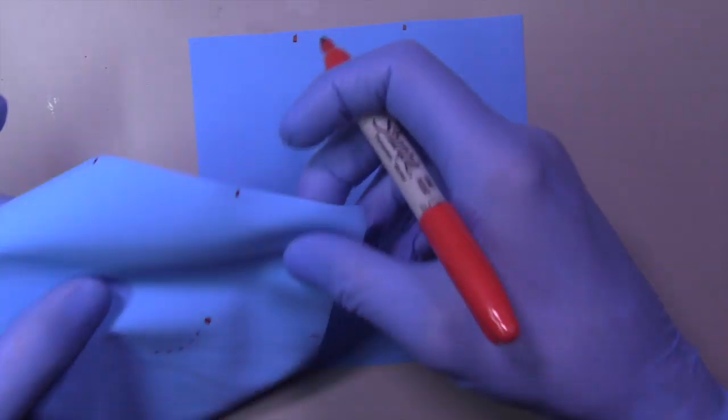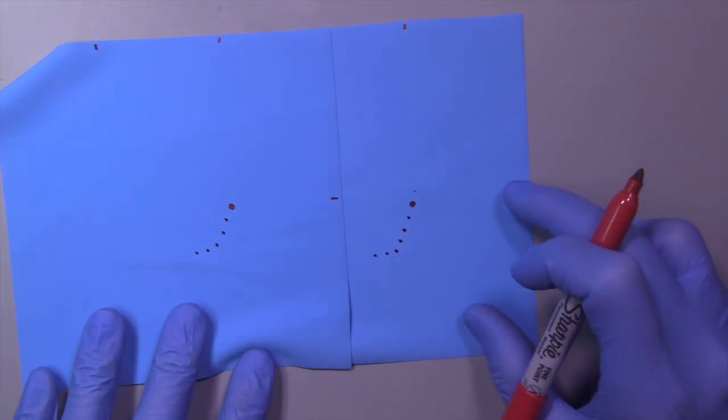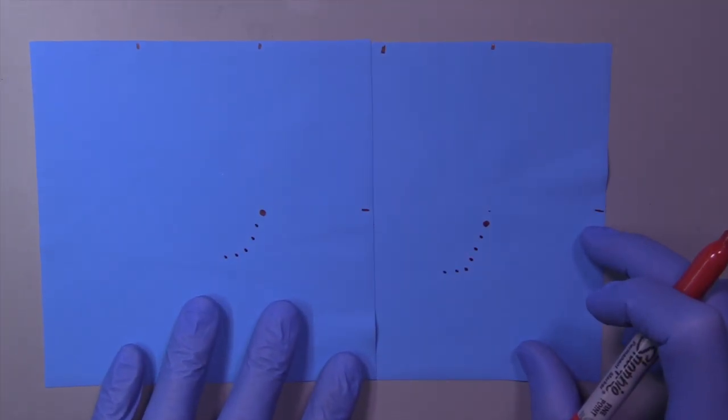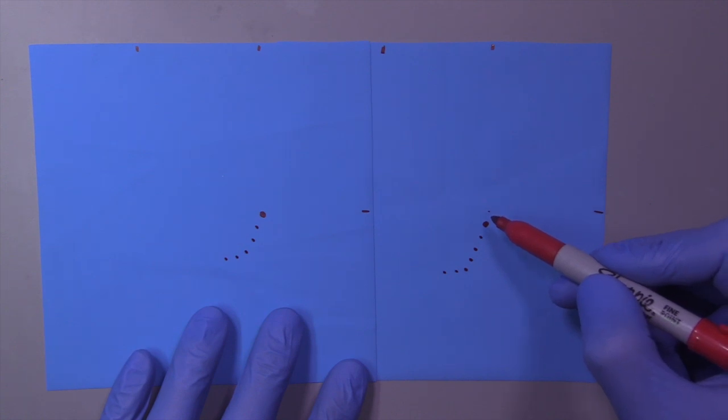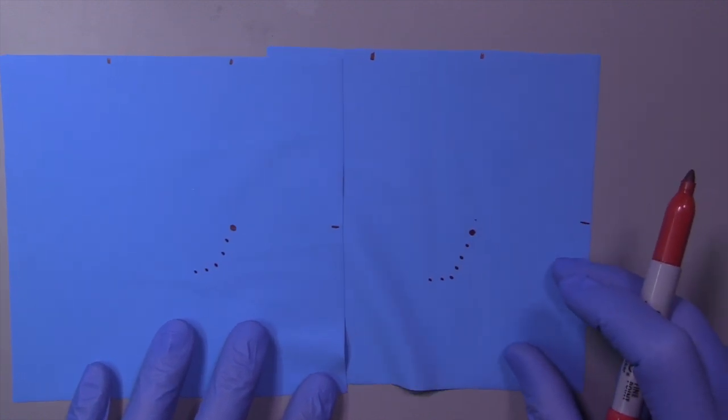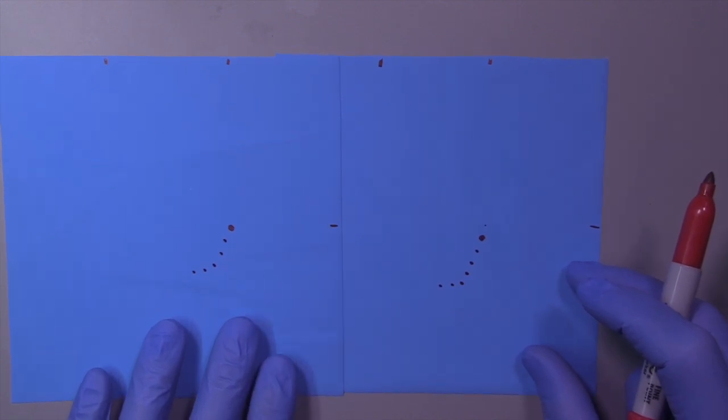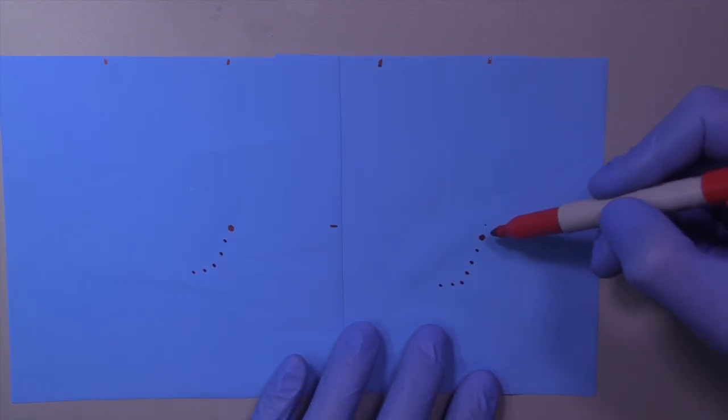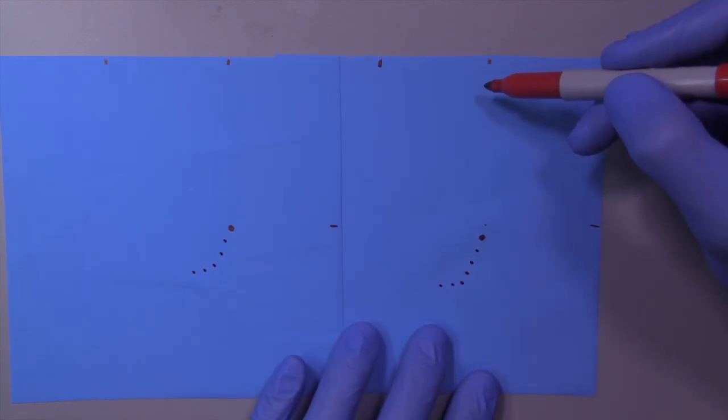Let's go ahead and hold these two rubber dams up next to each other. And on the left is the isolation from 19 to 24, and on the right is from 18 to 24. And you'll notice that the location for the hole of 19 is different quite a bit on both rubber dams.